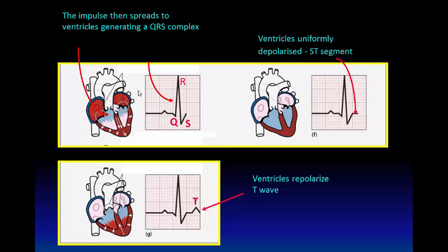So what will this give then in the ECG? Will the ECG needle move up, giving a positive deflection, or down, giving a negative deflection? This is a very important question.